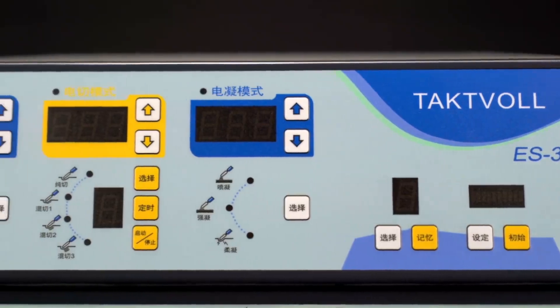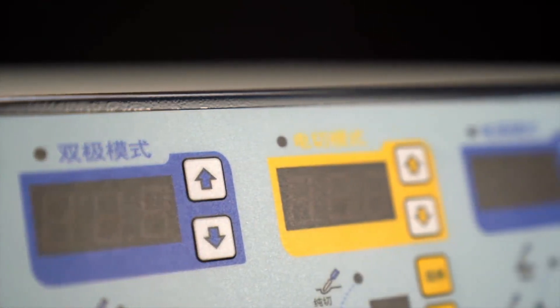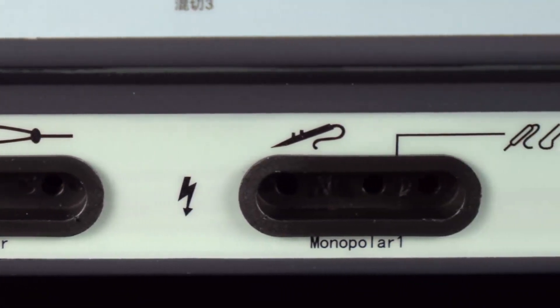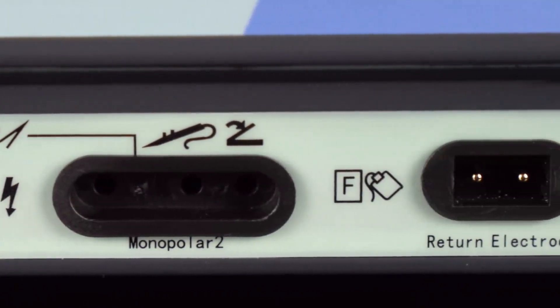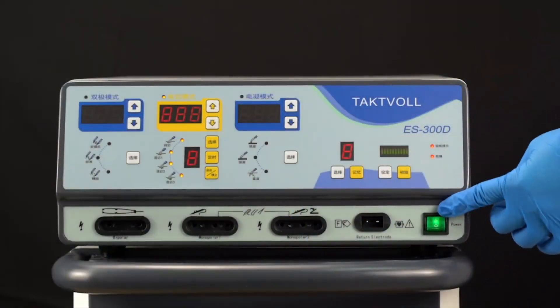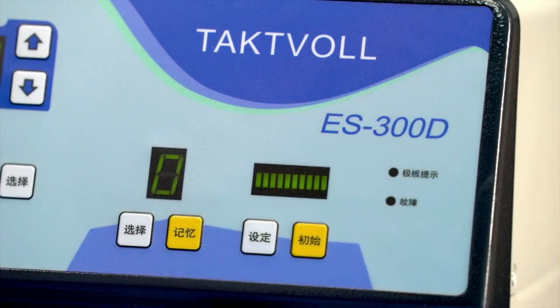With a clear and intuitive interface, in the three working areas — cutting, coagulation, and bipolar — the TactFall S300D adopts a standard interface design and can support the mainstream electrocutting and electrocoagulation equipment on the market. The S300D is easy and quick to install; the self-check program can be executed every time the device is turned on to ensure the device is always in the best working condition and performance.